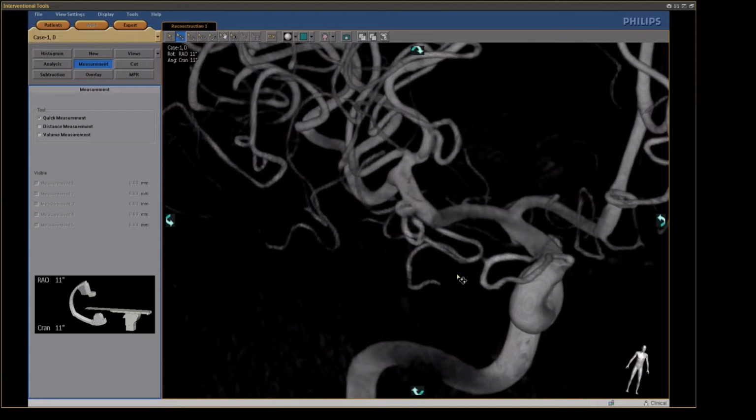This is a working projection, and the aneurysm is nearly 2 millimeters, 2.5 maybe, and the artery is nearly 3 millimeters. Unfortunately, we have no short flow diverters.